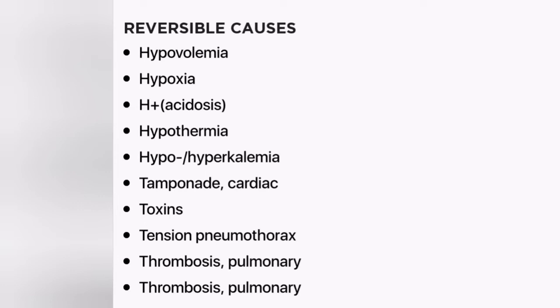If you see an irregular rhythm, like the one here, it is showing ventricular fibrillation. Immediately you have to attempt defibrillation at 2 joules per kg as soon as your defibrillator is available. And after making this defibrillation, you resume your CPR, and you have to attempt to identify reversible causes of arrest, the H's and T's, and do not interrupt the resuscitation.